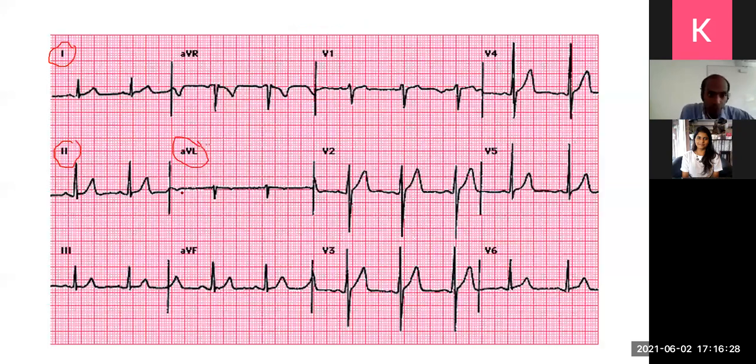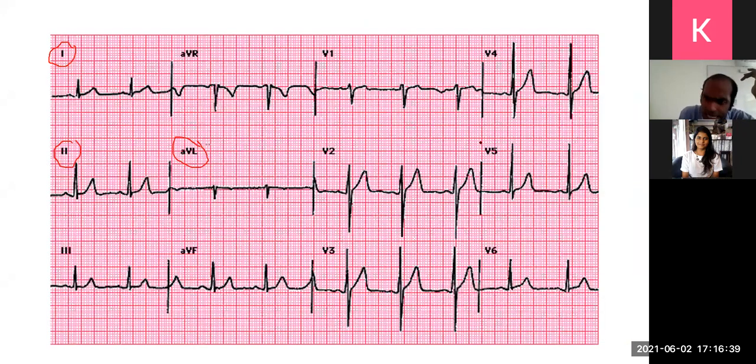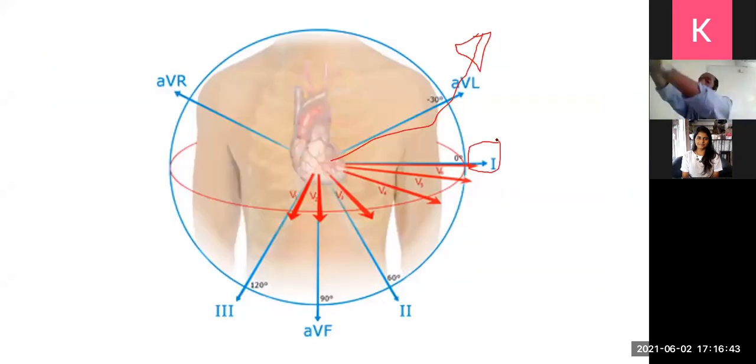If you look carefully now, what happens to 1? 1 is still positive. The current is traveling to that lead. It's positive.